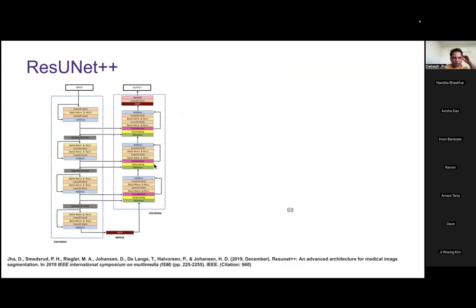Then this is another algorithm I developed. This is also an encoder-decoder network, and it is almost based on the residual block. So the input is passed through the residual block, and then again passed through the squeeze and excitation block, where the extracted feature gets squeezed and the useful information is kept.